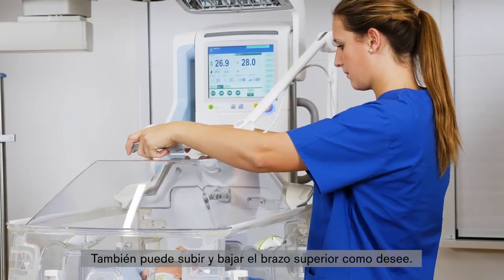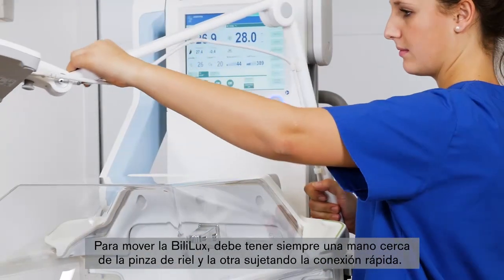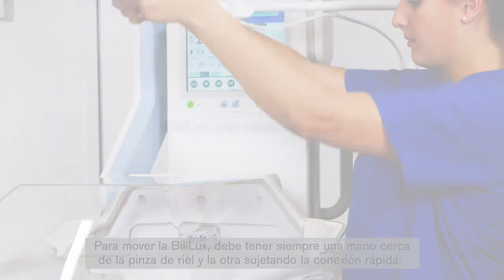You can also move the top arm up or down as needed. To move the Bililux, you should always have one hand close to the rail clamp and the other holding the quick connect.